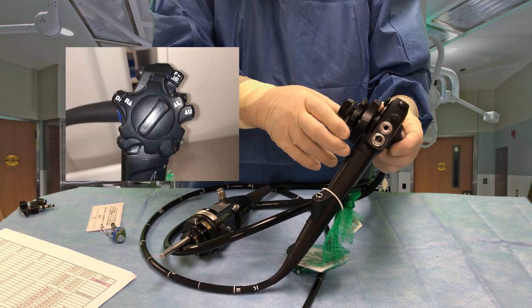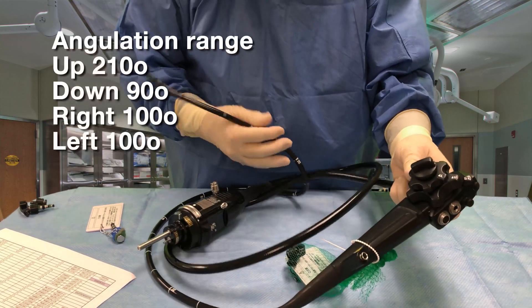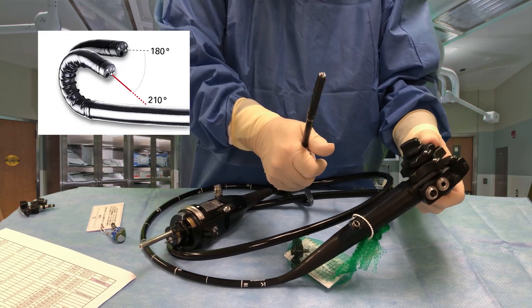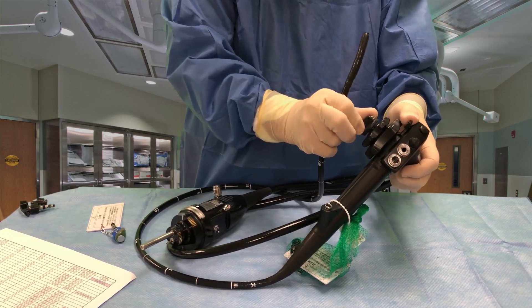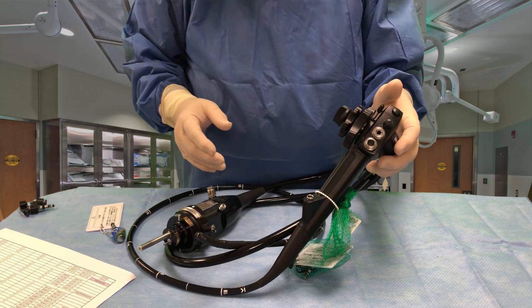It still has the up-down lever and the left-right lever, so if I hold the bending section here you can see we can go up, right, left, down. It also has locks here so I can lock into the position I want. We leave these in the free position when it's not in use.